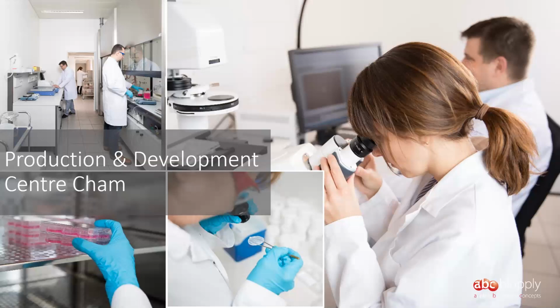And it's also possible to add new medium without dislodging or displacing those microspheres, microtumors. So that is easy. It's also easy to see the chip because the chip acts like a sponge, so it normally gets red from the color of the medium. Even if the medium wouldn't contain any color indicator, it's still easy to see it because the concentration of the agarose is such that you can detect the chip quite easily by eye.